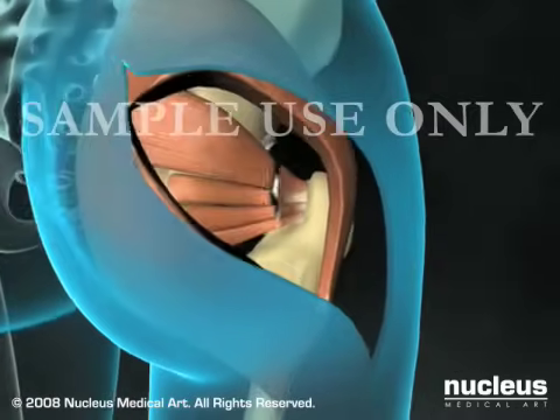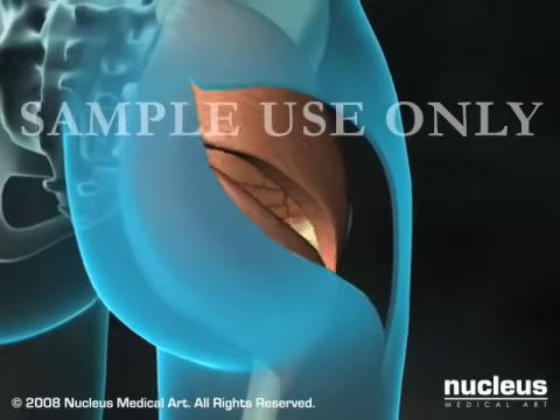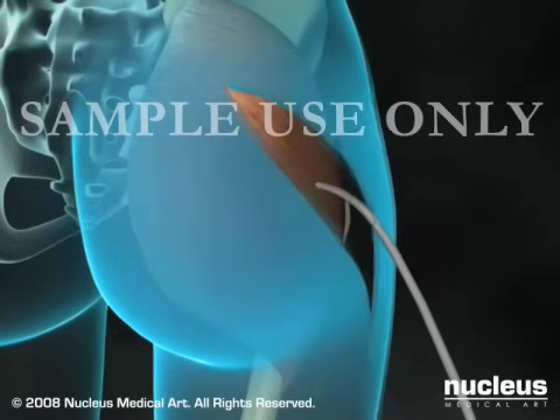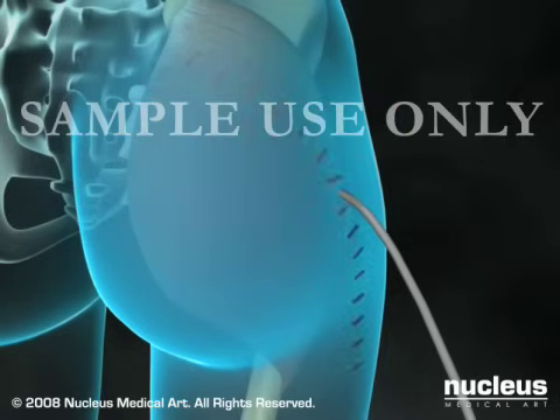Your surgeon will then close the joint capsule, repair the muscles, place a drain in your hip to remove excess fluid, and close the incision with stitches or staples.